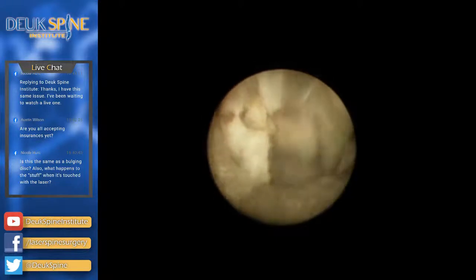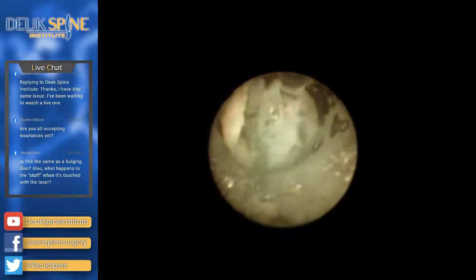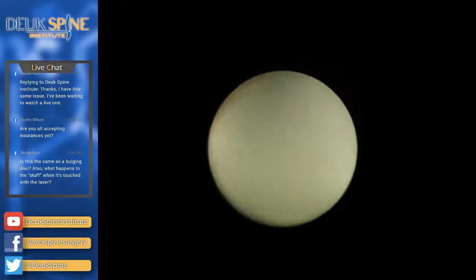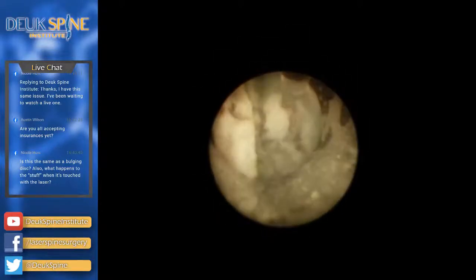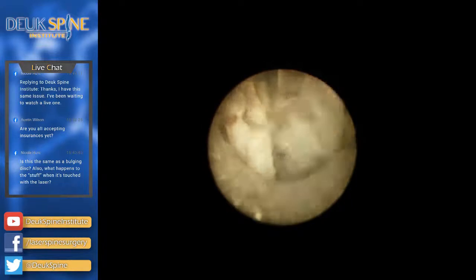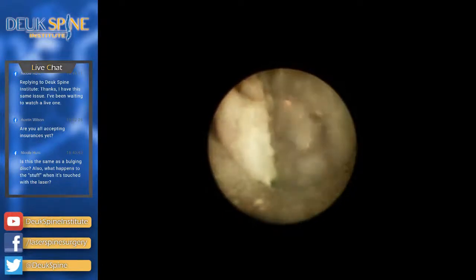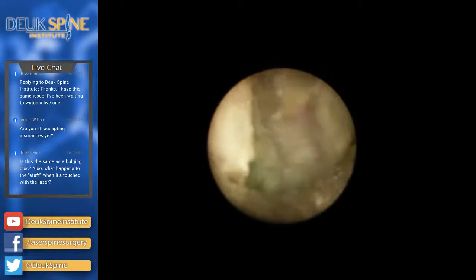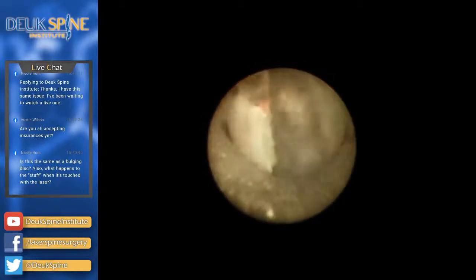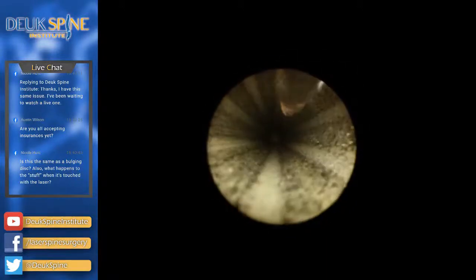Oh yeah, come on, get out. Get out of there. These are like little demons. No, don't you go hiding. I'm not going to let you hide in there. There, yeah, the last bit of the herniation. You can actually see the spinal cord below it. So, I just got to rock this little piece out of here. Come on, man. Don't make me zap you completely. Sometimes these herniated fragments, they just don't know when they've lost. There we go. Yeah. We have a cheer.